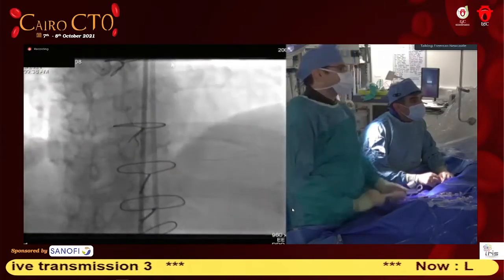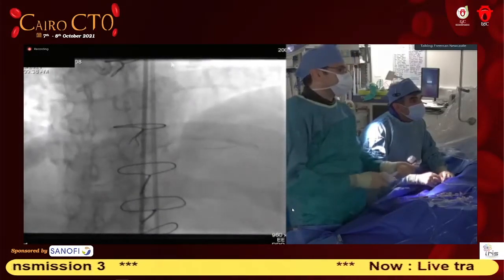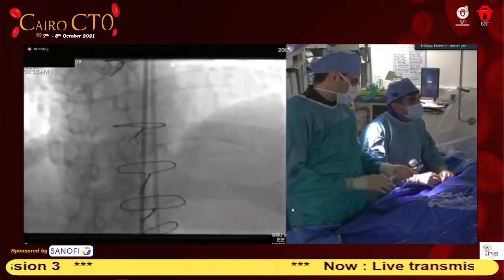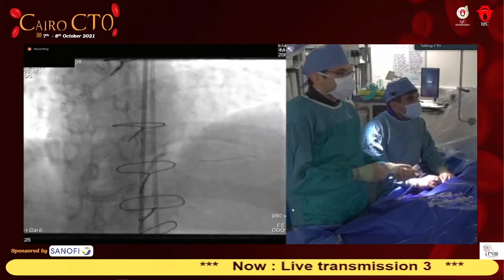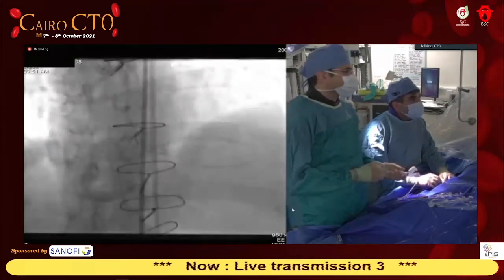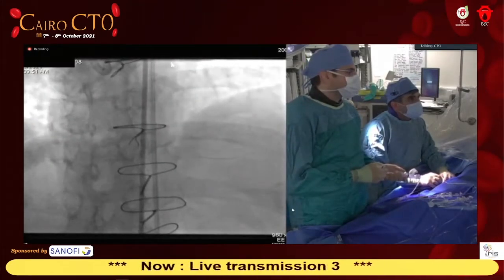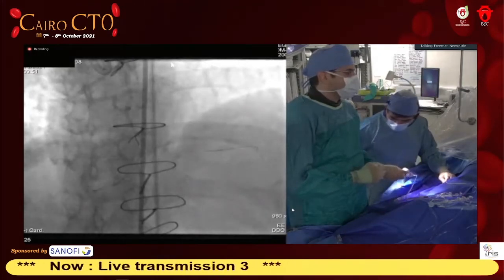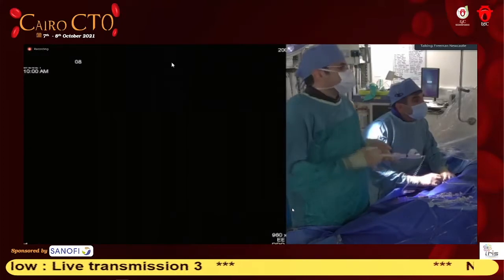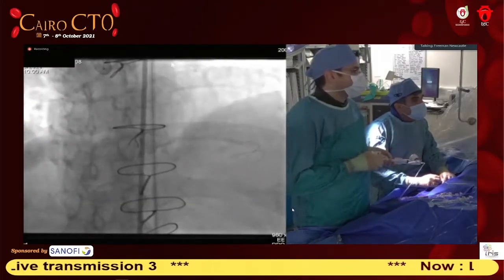Yeah, so go up there. 8, 10. Severe bend, really. It's a 3 millimeter balloon? No, this is 2.5. 2.5, okay. But you notice, I tried to get that with the other wire in place. I could not advance this balloon, moving the wire.